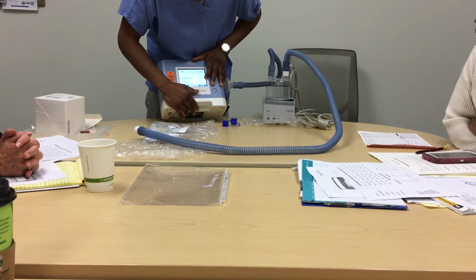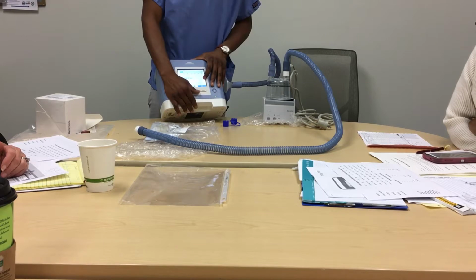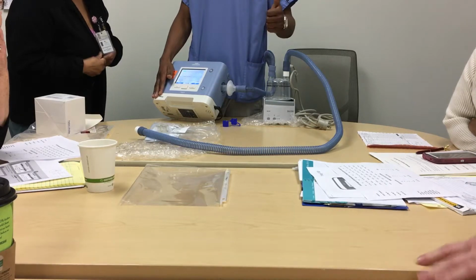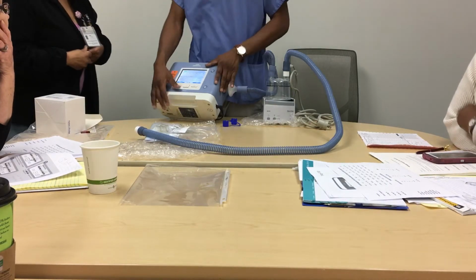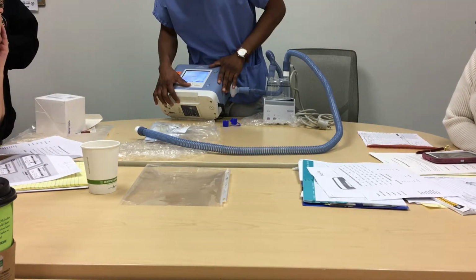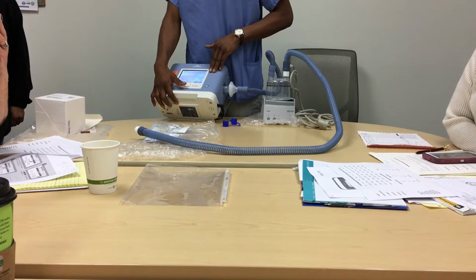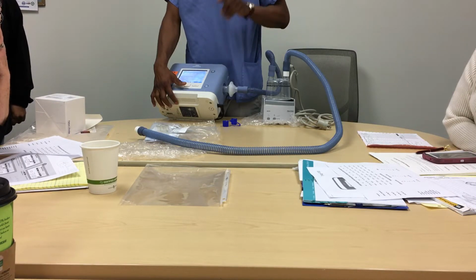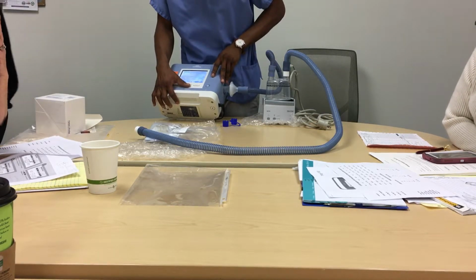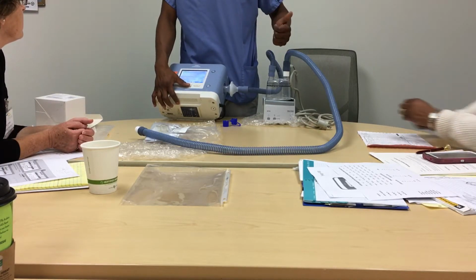Okay, so if we scroll down to the trigger types, again for neuromuscular, we have the option to do flow, auto track, auto track sensitive, and nowadays I see them lean more, especially long-term neuromuscular, to auto track sensitive. I was thinking that would be it. Yes. With that, we could dial in the right time. Yeah, the flow trigger sensitivity.